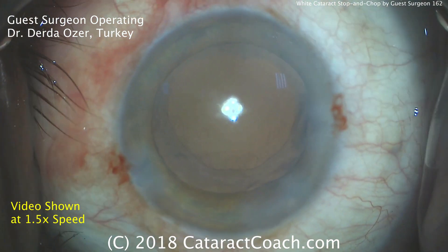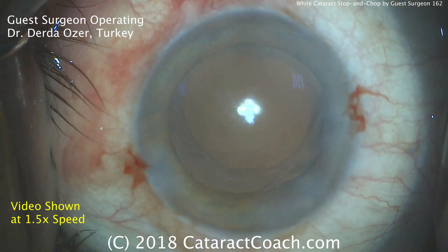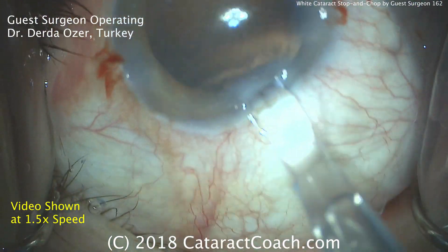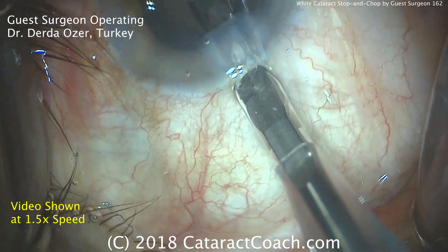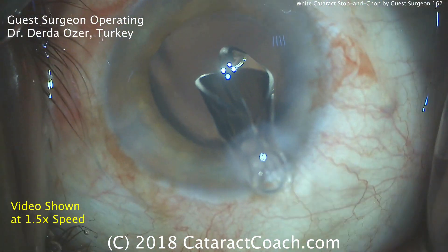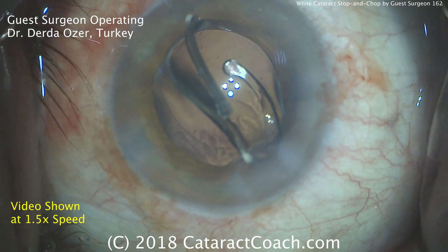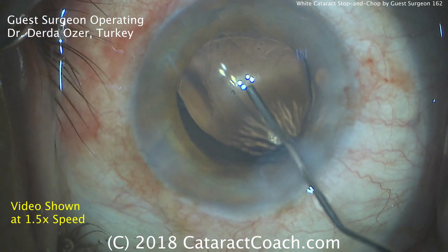The lens is coming in — it's going to be a single-piece acrylic lens going through that small incision. The lens loading is happening now. You can see the little saccades or patient movement, telling us the patient is under very light sedation — that's probably the breathing. There's the lens being delivered with a wound-assist technique, so no enlargement of the wound. This is a double-handed injector, so both hands are needed. That allows the surgeon to use a small — probably 2.2 to 2.4 millimeter — incision for the whole phaco as well as deliver the lens.